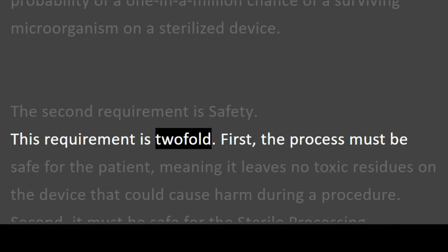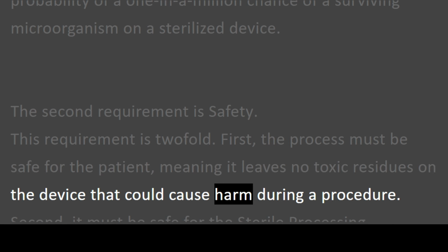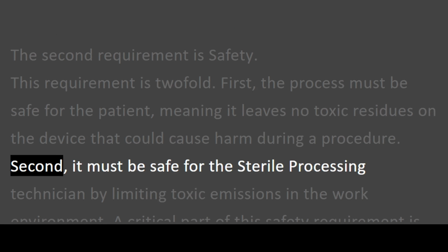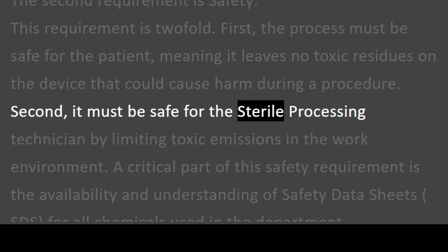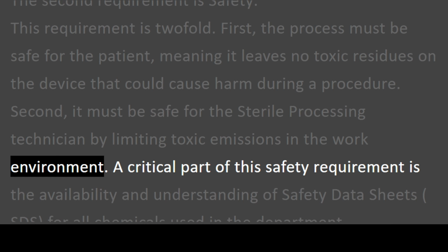This requirement is twofold. First, the process must be safe for the patient, meaning it leaves no toxic residues on the device that could cause harm during a procedure. Second, it must be safe for the sterile processing technician by limiting toxic emissions in the work environment.